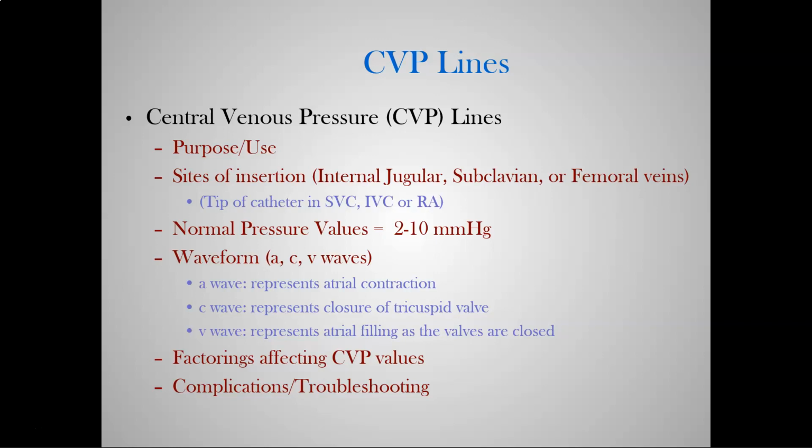Now, these are not standalone measurements by themselves, and are not direct indicators. For example, let's say I have a reading of 18. Okay, that says I have severe fluid volume overload. Well, my blood pressure is 90/60. I don't have any pulmonary edema. I don't have crackles. Okay, we're not just going to automatically dump 40 to 80 of Lasix into you and hope that you urinate out your excess volume. We are going to keep a close eye.